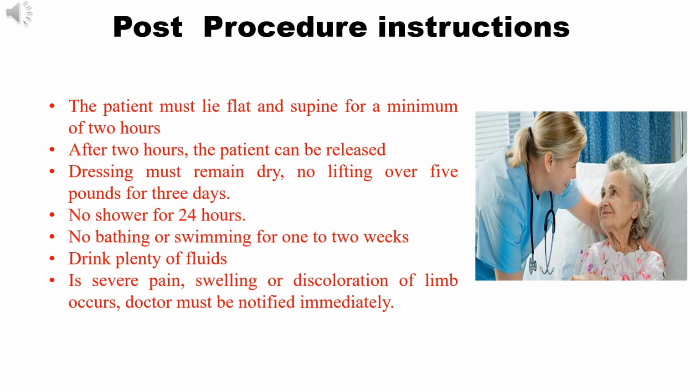After the procedure, what instructions should be given to the patient? The first one is that the patient must lie flat and supine for a minimum of 2 hours to ensure the artery does not reopen. After the 2 hours, the patient can be released to a person driving the patient home.